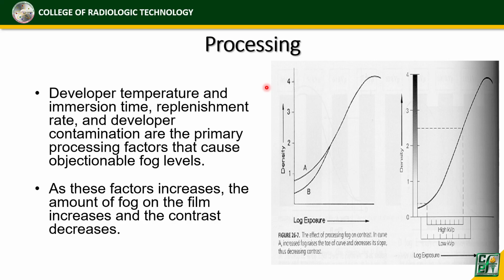Kasi nga, contaminated ng fixer ang developer mo. Instead na magde-develop yung film mo, magiging ang action na ng iyong solution ay fixation na. Mag-a-act na siya as a fixer. Pinapawalang bisa ng fixer yung developer solution.